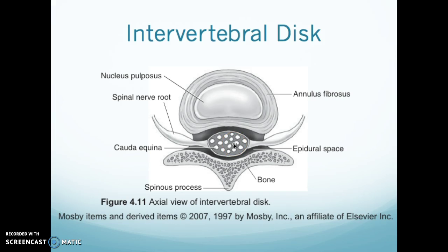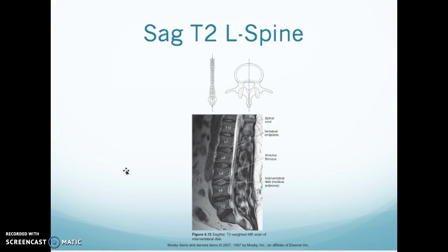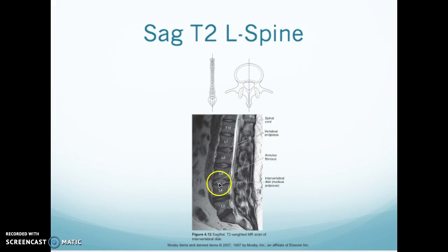Here is your epidural space with your bone. The cauda equina is just the nerves free-floating within the CSF. Coming out you have your nerve root, and any kind of impingement is what you feel as shooting pain down your legs. On sagittal T2 of the lumbar spine, you can see your cord coming down to where the spinal cord ends, and then this is your cauda equina. Here's T12, L1 through L5, then into your sacrum. The black part is your annulus fibers.